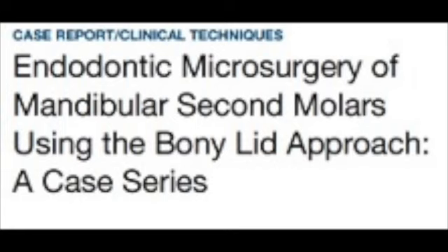Due to their thick buccal bone, poor visibility, and the potential of neurovascular complication, all of these factors make it quite challenging to do apical surgery on these kinds of teeth. So this group applied the Bony Lid approach with the aid of CBCT in 10 cases of endodontic microsurgery for mandibular second molars.